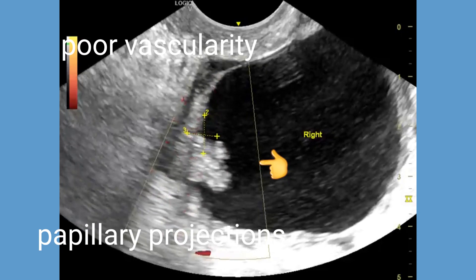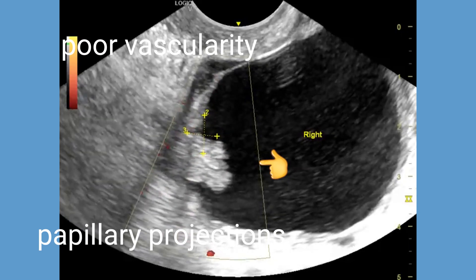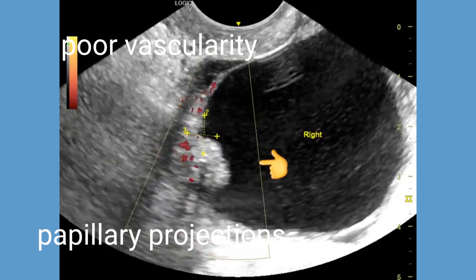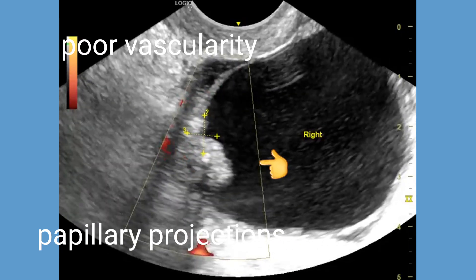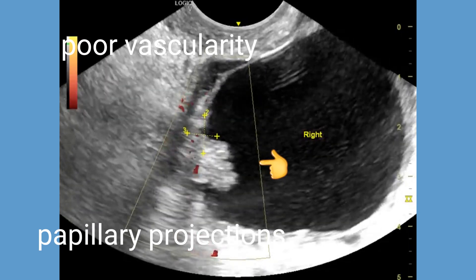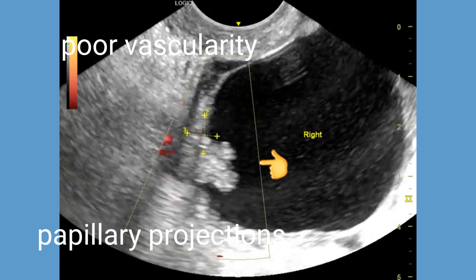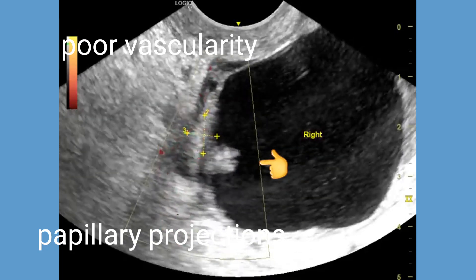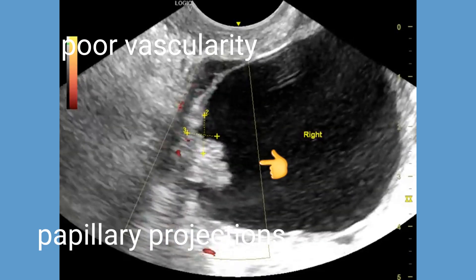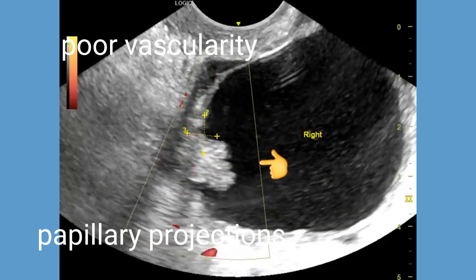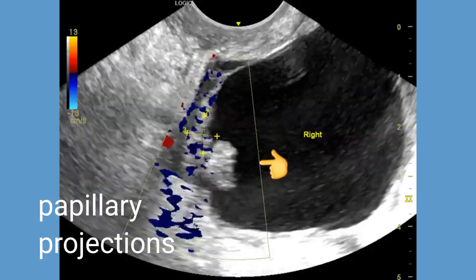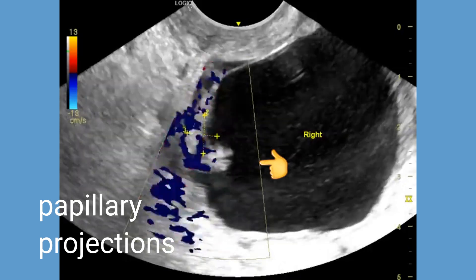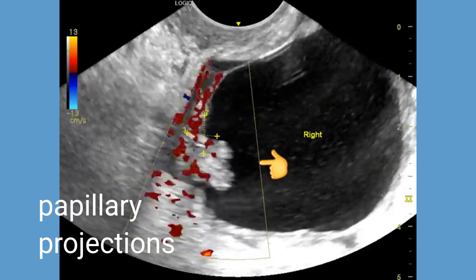The left ovary is normal and there is no ascites or lymphadenopathy. This case is challenging because the cystic mass with a mural nodule and papillary projections could represent a benign or malignant ovarian neoplasm.